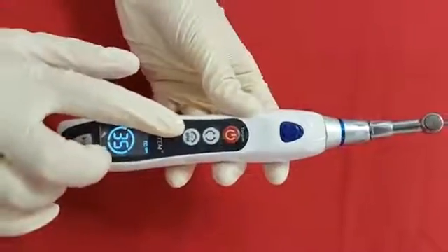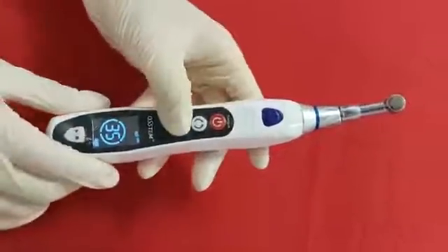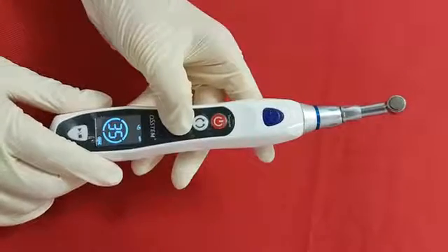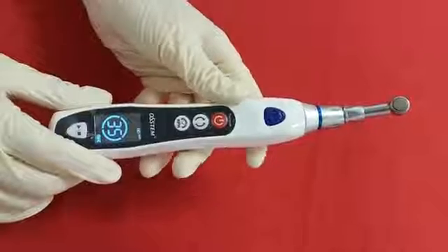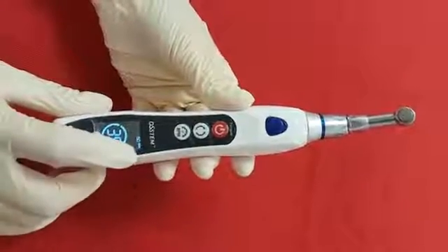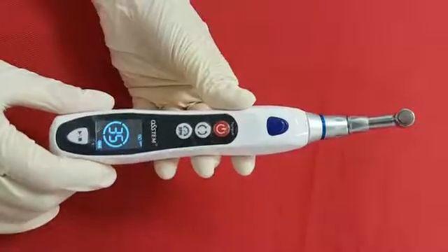Right next, speed control button. The lowest speed is 15 RPM and the highest is 60 RPM. When you press this button, it increases by 15 RPM at one time, and you can check the speed change on the top of the LCD.